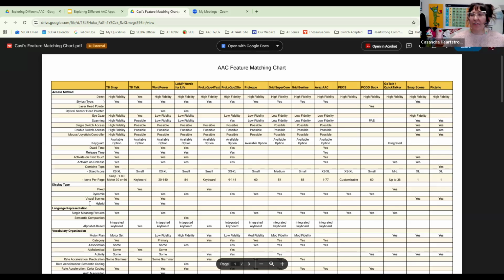Yeah, people have lots of different needs. For instance, an individual who has access to their hands and fingers, meaning they can operate their hands and fingers, is going to access a device differently than someone who cannot move their arms or who doesn't have any arms. Somebody is going to access it differently if they are totally blind. They're going to access it differently if they have limited control of some of their arm movements, but have a little bit of motor control there.